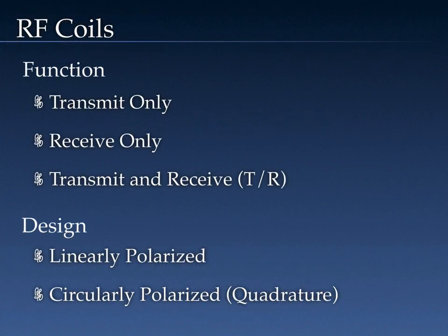As a bit of a review, remember that radio frequency coils are configured to function in one of three modes. They can be designed to only transmit RF or to function as a receive-only coil. Coils can also be designed to function as both a transmit coil and a receive coil. With regards to safety considerations, only coils that can transmit will be of concern in most clinical situations.